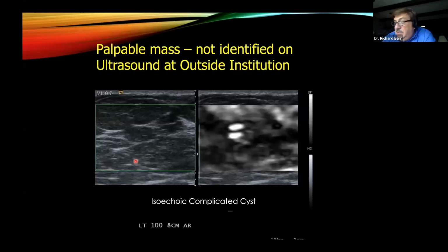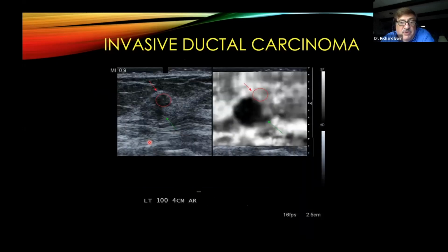Just some quick clinical cases as we're running out of time. This patient came in, a 40-some-year-old lady that had a palpable mass. She had been seen somewhere else. They couldn't find anything wrong. They sent her to us. Here's our B mode image. And here you can see nothing of interest, but we put the transducer over that area. We do our elastography, and we get a perfect bullseye artifact. So this turned out to be a complicated cyst. So we stuck a needle in and aspirated it. It went away, and the palpable mass went away.